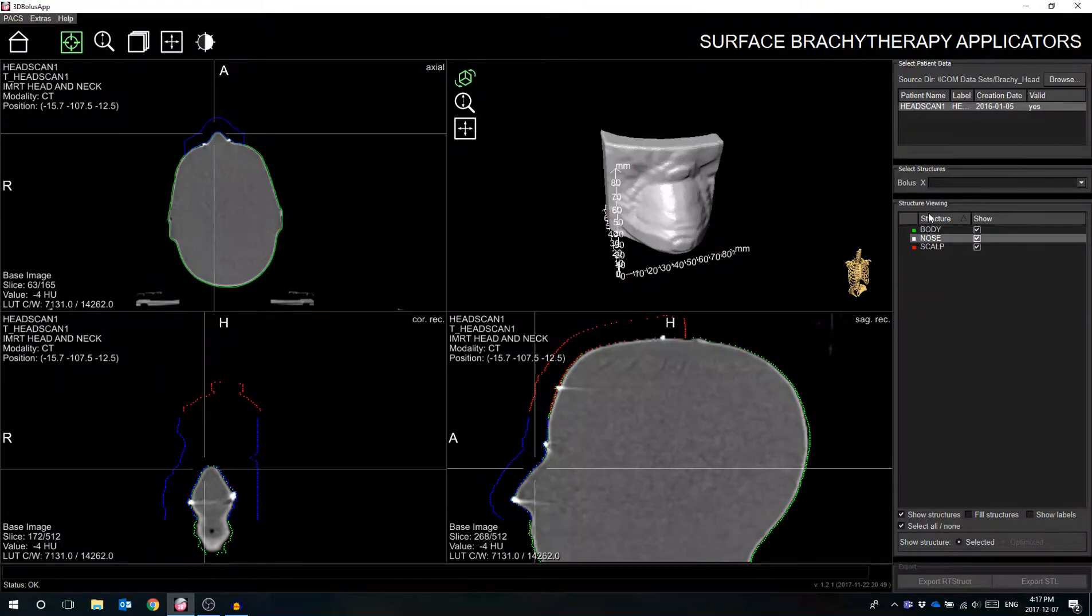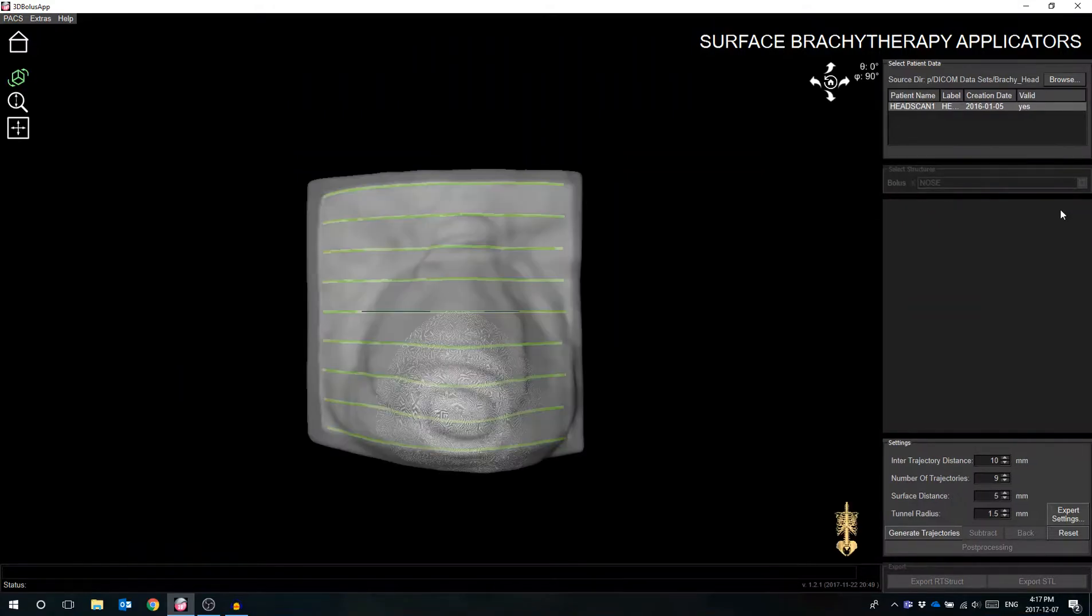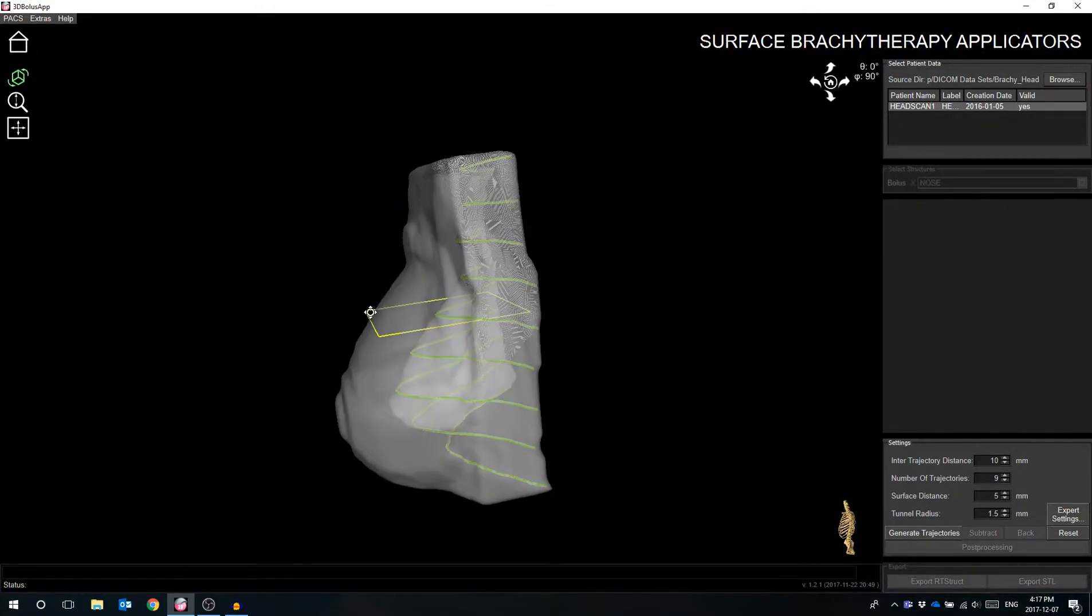From the drop down menu, the user can select whichever structure they wish to be used as their surface applicator. For this video demonstration, I will be selecting the nose structure.